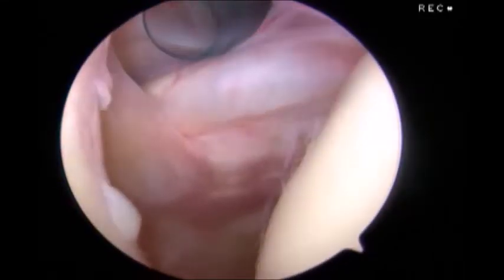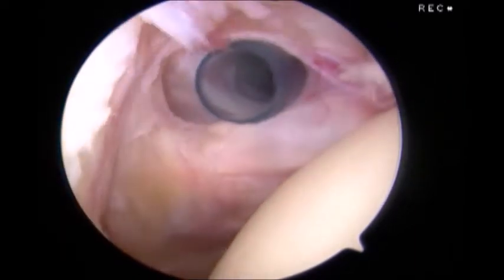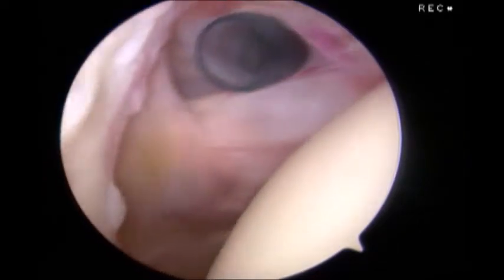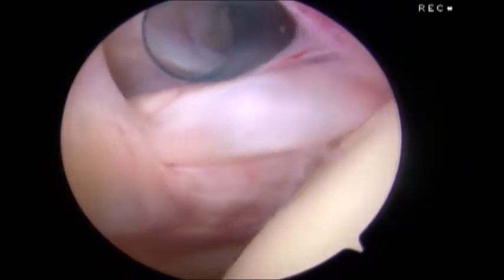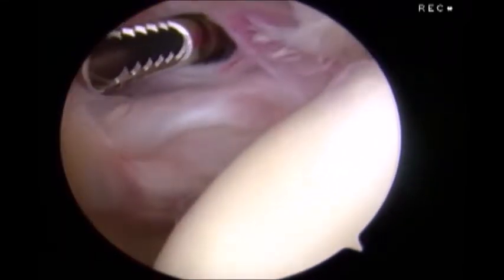The bellows sign also occurs in the subscapularis, and we can see here in the right shoulder with internal and external rotation of the shoulder, the bellows sign with changes in the external surface of the subscapularis as fluid moves in and out of the defect created within the subscapularis tendon.